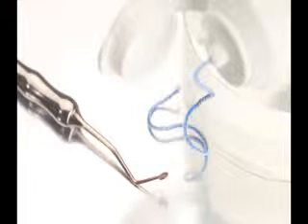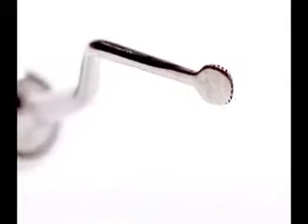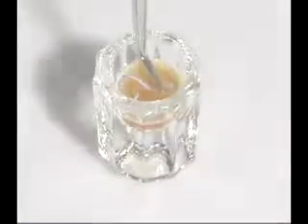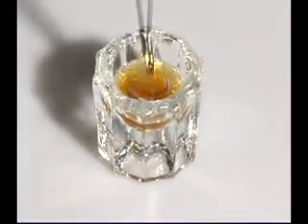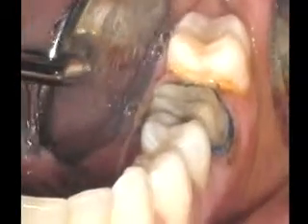In general, knitted cords are most easily placed with a thin packing instrument. ULTRADENT offers serrated packers and the large and small slide packers. An ULTRAPAK knitted cord is soaked in Viscostat and then packed into place. After packing, rinse the area.